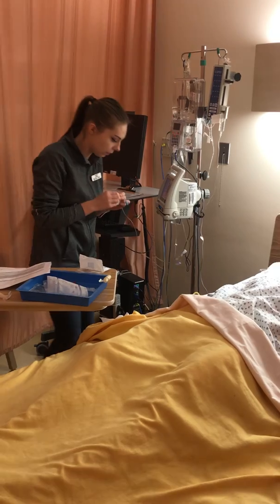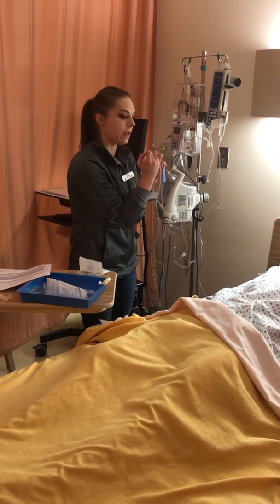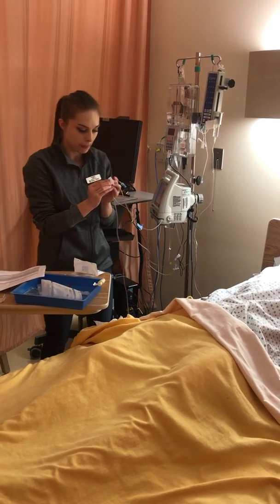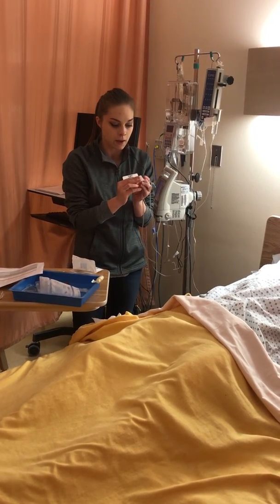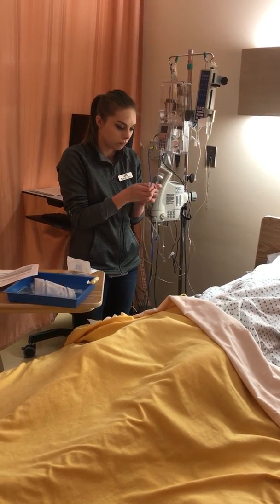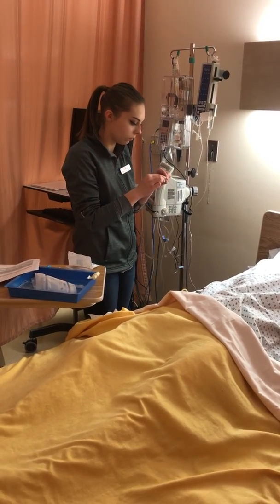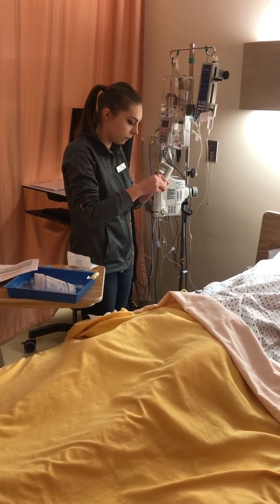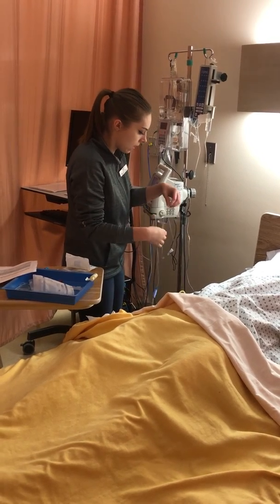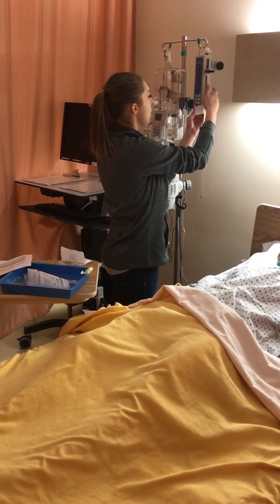So now I'm going to swab. I'm going to do the middle so that it leaves the closest port open for IV push if necessary. So I'm swabbing for 30 seconds and then letting it dry. I can unclamp this. I'm going to start it at normal.